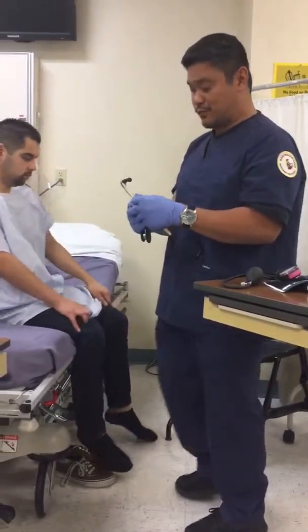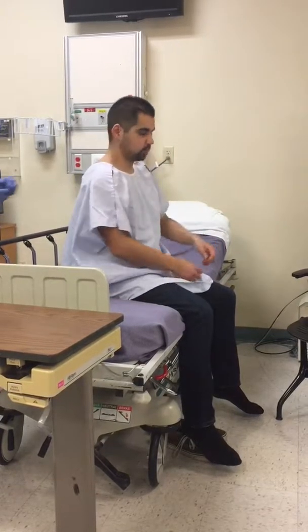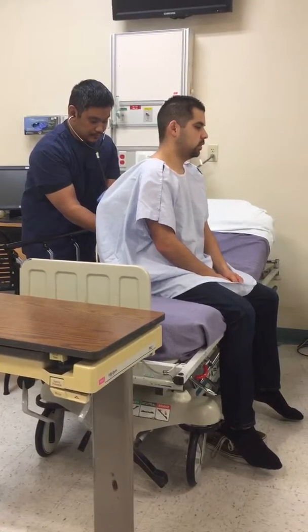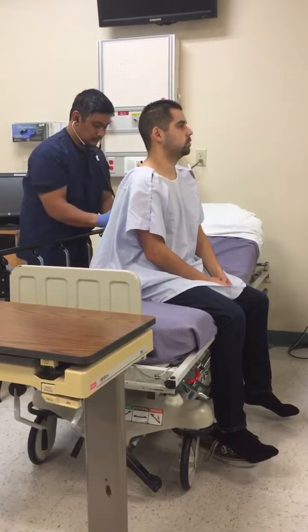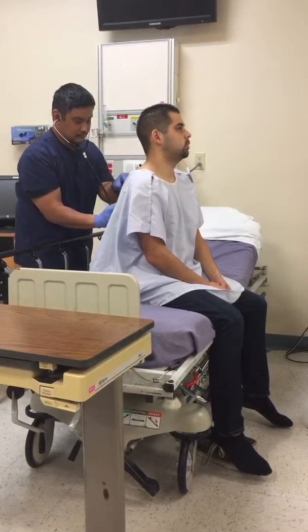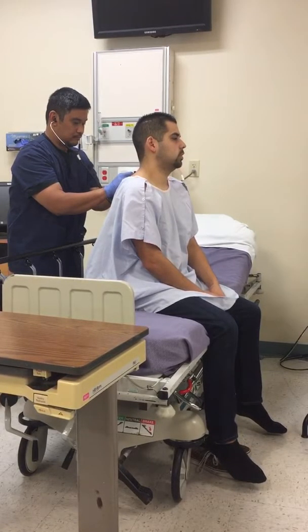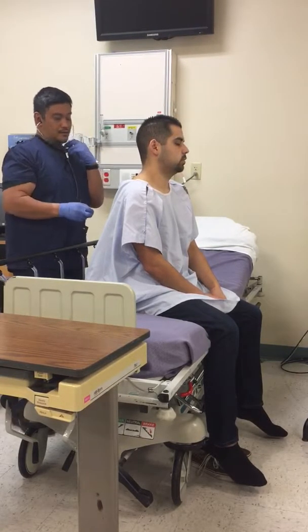We're going to start from the back like before. So whenever you feel it, just go ahead and take a deep breath in for me, okay? All right, thank you, Christian.